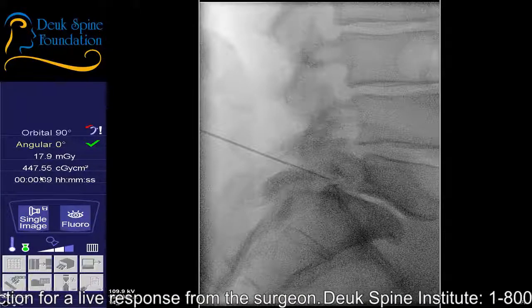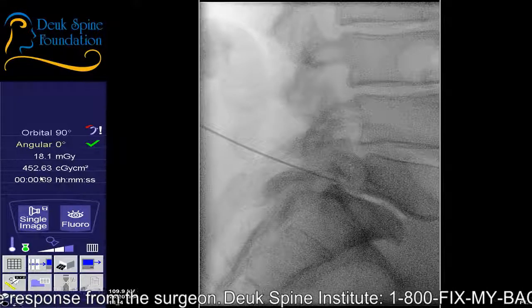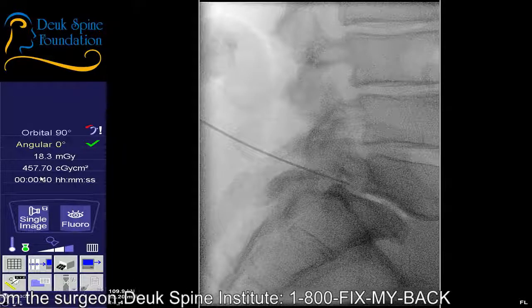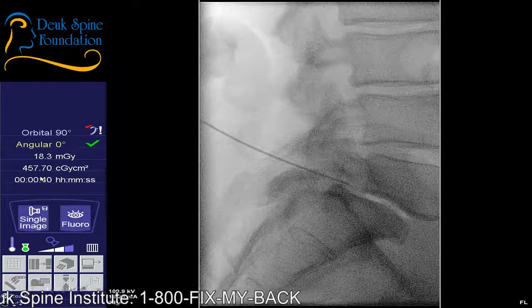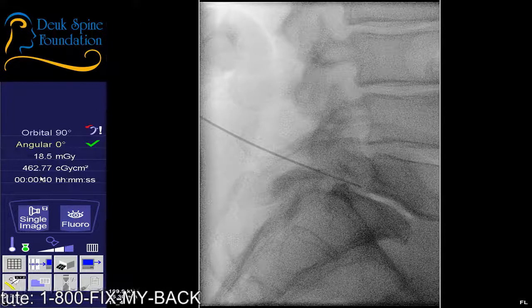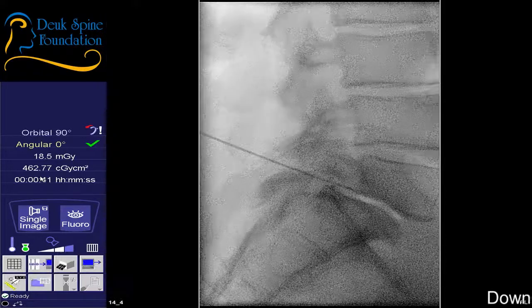Shot. Gonna end up in the same place again. Shot. Any discomfort? Where do you feel that? Better than it was. All right. Shot. Yep.